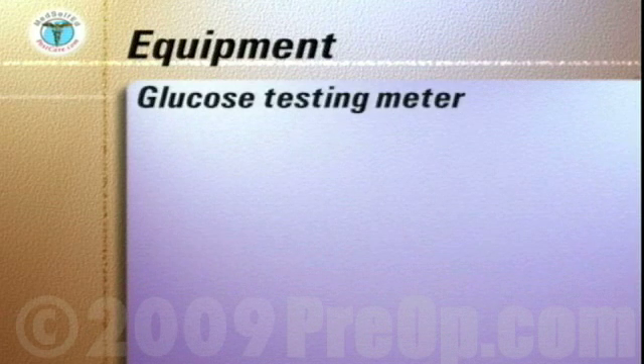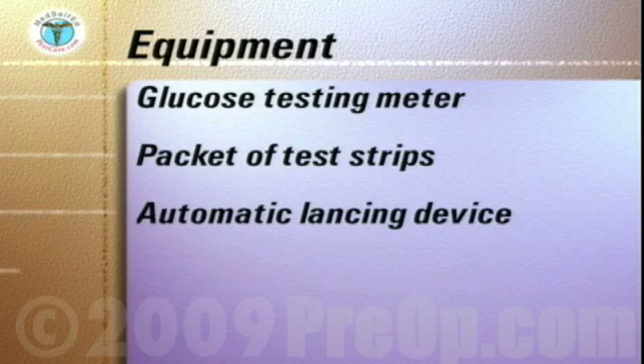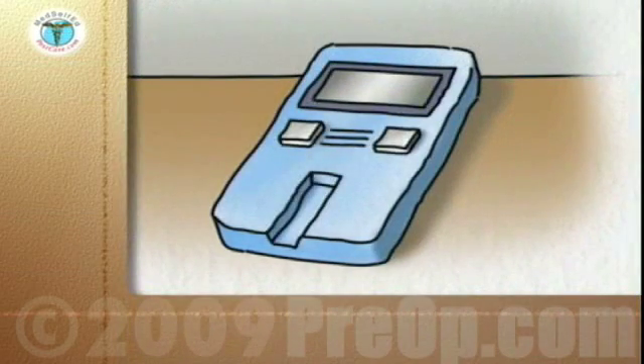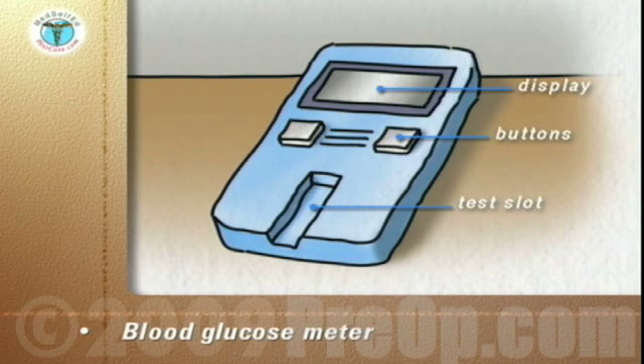The equipment you will need to assemble includes the glucose testing meter, a packet of test strips, an automatic lancing device, and facial tissue. The meter will have a display with blood sugar readings, an on-off power button, and a slot into which the test strips are inserted. In the back of the meter will be a compartment for batteries.